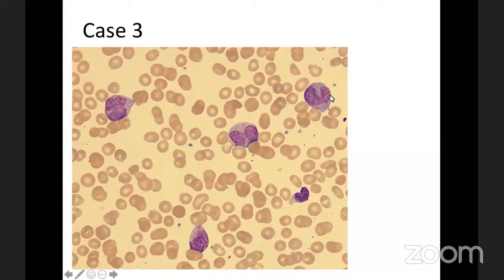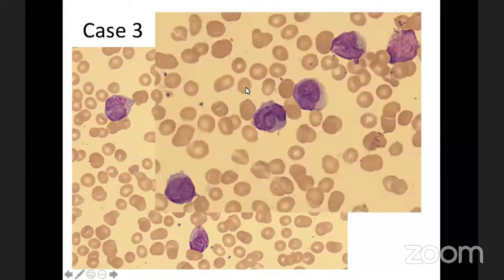So we have a uniform bilobed butterfly abnormal morphology, and we have these fine granulations in the cytoplasm, which goes with the hypo or microgranular variant of M3. And also, you can notice that we have a cupping here, or thumbprint, or drop of water over the nucleus.